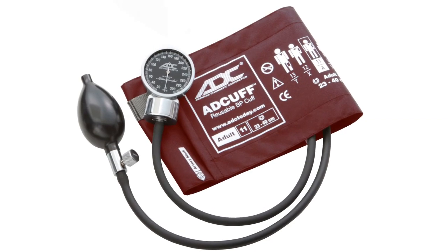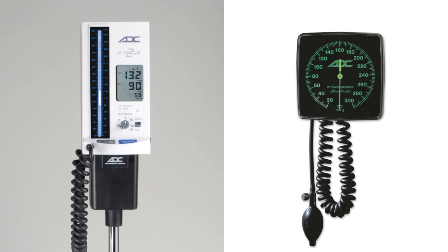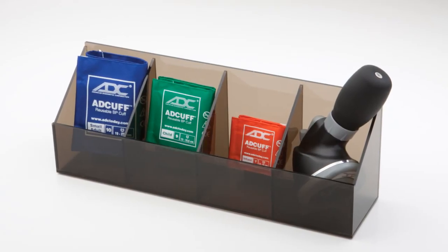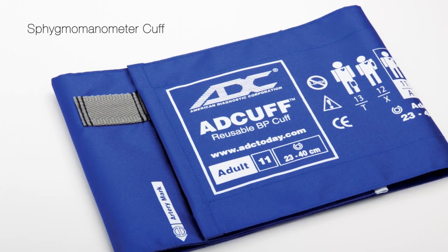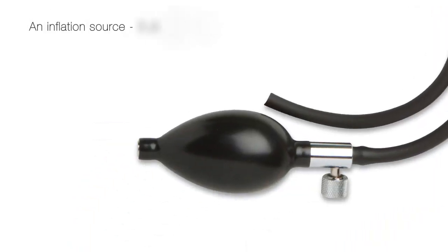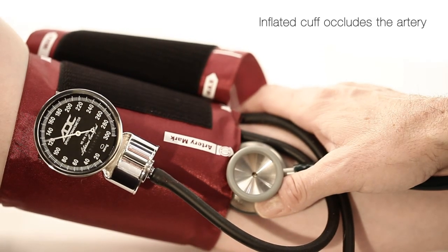ADC is a leading manufacturer of manual blood pressure instruments known as sphygmomanometers. Although there are literally hundreds of model options employing many different technologies, they all share one component in common: the cuff. That is why we refer to the cuff as the heart of the system. A typical modern cuff consists of a number of components. The bulb and valve pump air into the cuff and bladder, which fills and expands to compress the artery.